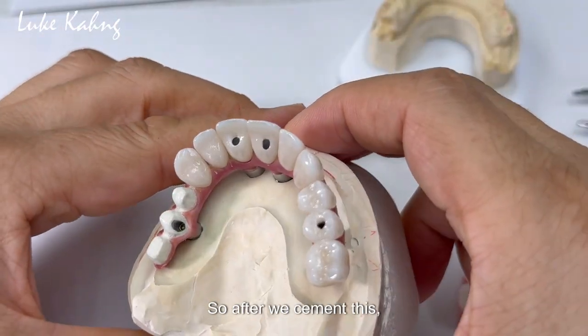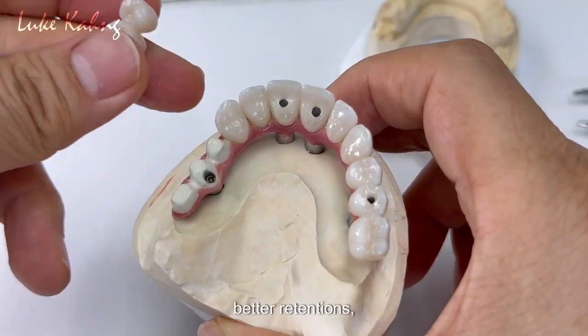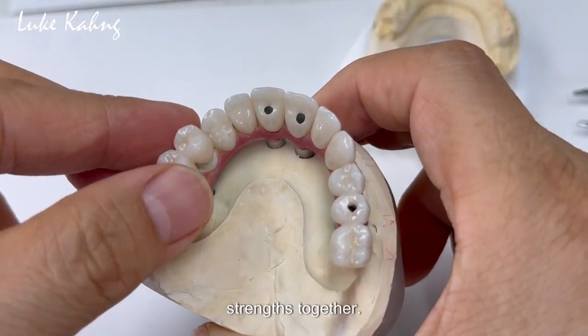After we cement this, they will get more retention — better retention. It creates tensile strength together.